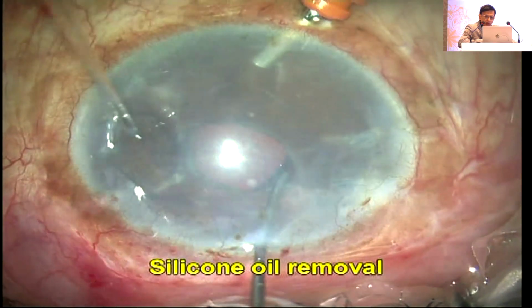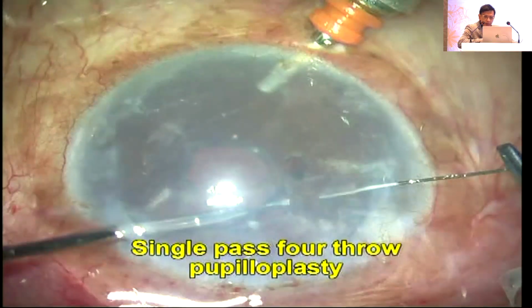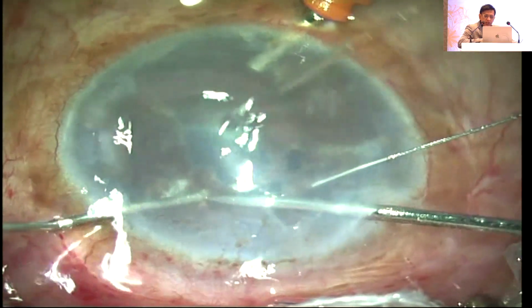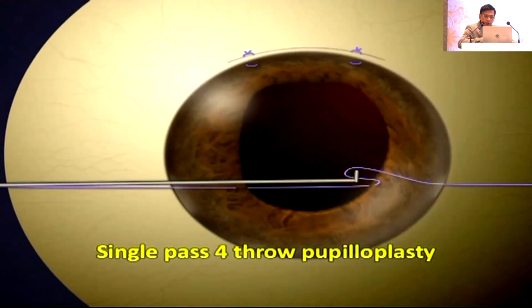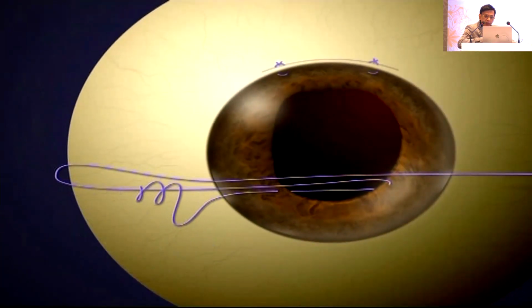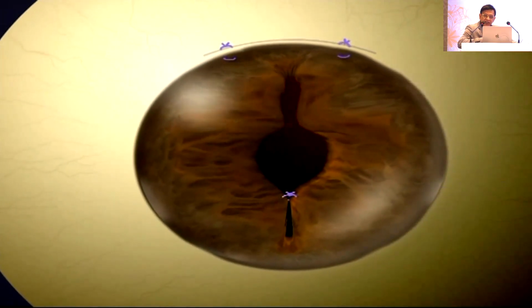This was a case referred by a top retina surgeon, Dr. Natarajan, one-eyed patient. You see, there was silicone oil there, so I've just taken off the silicone oil. Now you can see that pupil is bad, so I prefer to do a single pass, 4-throw pupiloplasty the way Ashwin showed. You can see the same animation, pass it from one end, bring it out, remember the number 4, and pull on both ends, and that is game, set, and match.